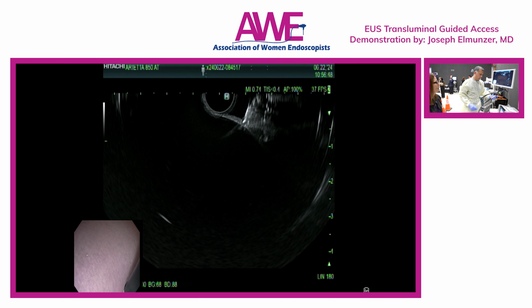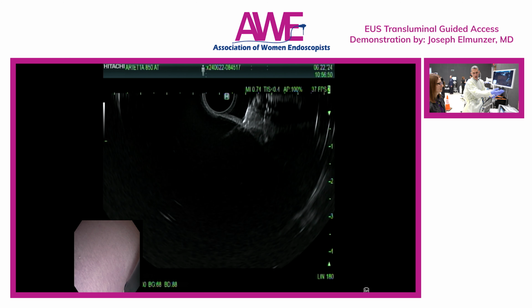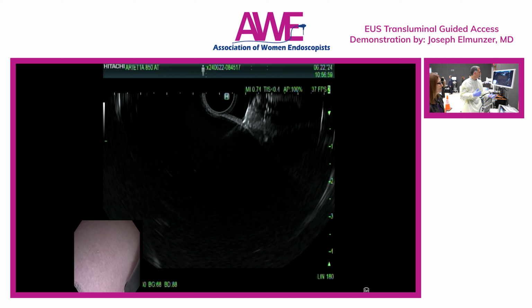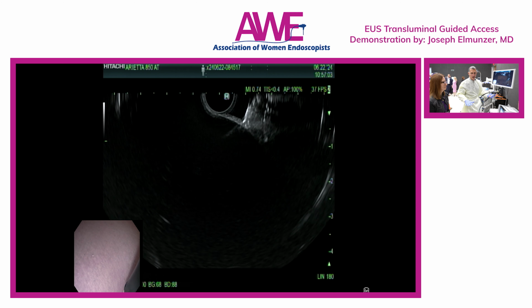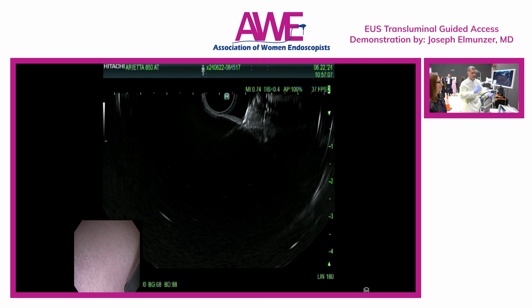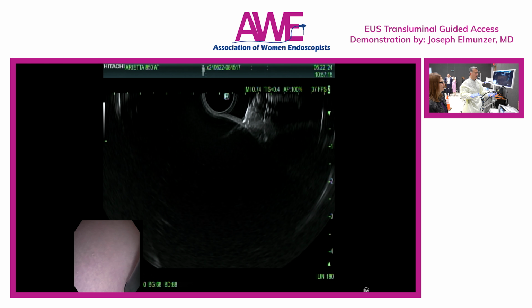Exactly. And so typically you wouldn't hook up until you're ready, but we're hot now because we're ready. And again, our tendency is to puncture through just because of FNA. So we're going to be really disciplined about the fact that I'm going to step on it for a split second, let it heat up, and then advance slowly and steadily. And then what we ideally want to see on the screen is the bubbling effect of the heat within the target fluid. And once you see that, then you know you're in good shape.